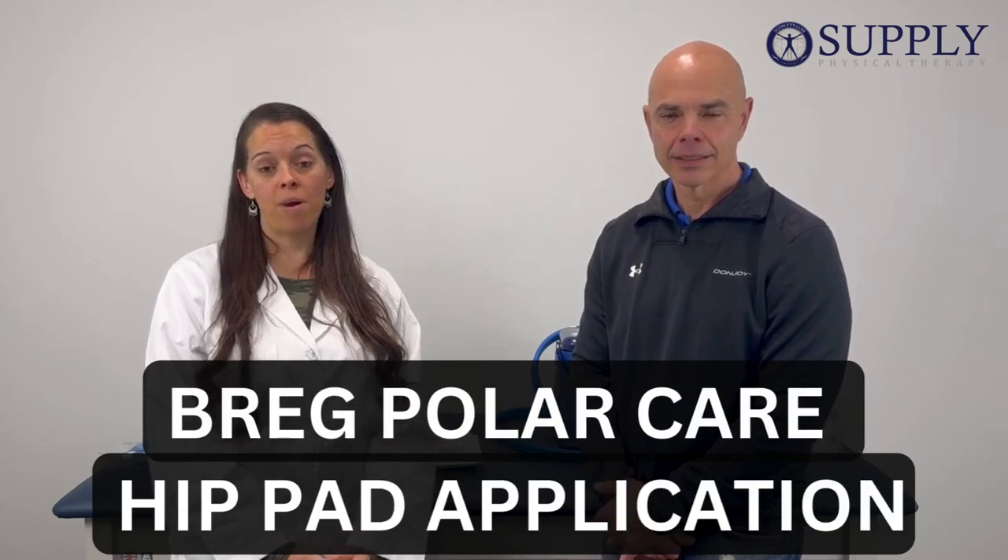Today we're going to discuss how to apply the Breg Polar Care Hip Pad, and this applies to both the Breg Polar Care Cube and Kodiak systems.